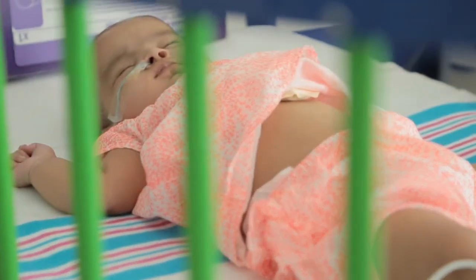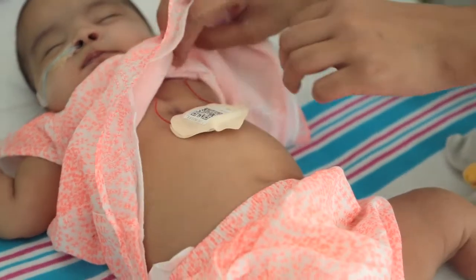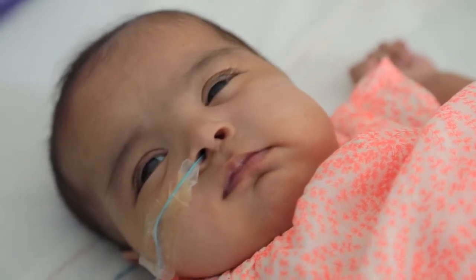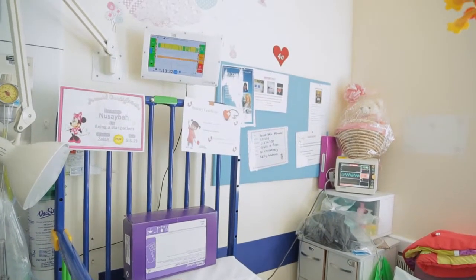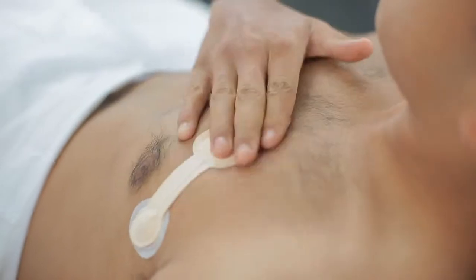So what it's doing is looking at every heartbeat. It's looking at the ECG trace and analysing that in the device itself to extract from the ECG some parameters of interest. We have a design philosophy of making things look really easy, really simple, and hiding the high-tech nature of them. So for that reason, it feels quite comfortable for nursing staff to use, and it feels quite comfortable for patients to wear as well.